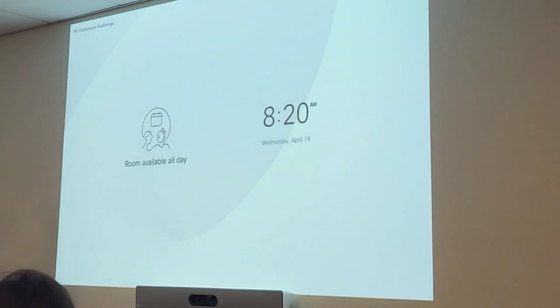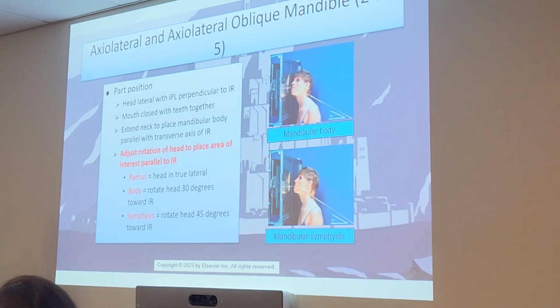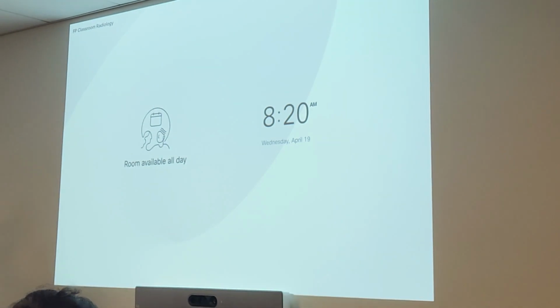And you'll notice on all 3, using the same angle though, that's a 25 degree cephalic angle. 25 degree cephalic angle on all 3 of those. Make sure you put a star by this because this is different from how you run it in lab.